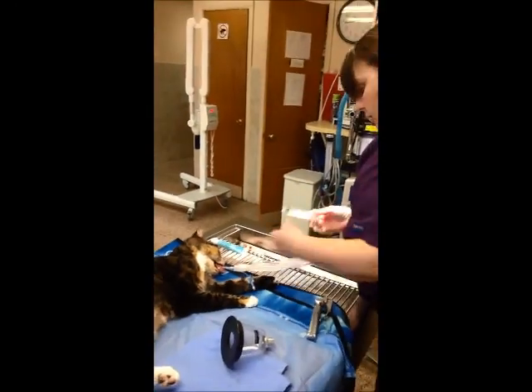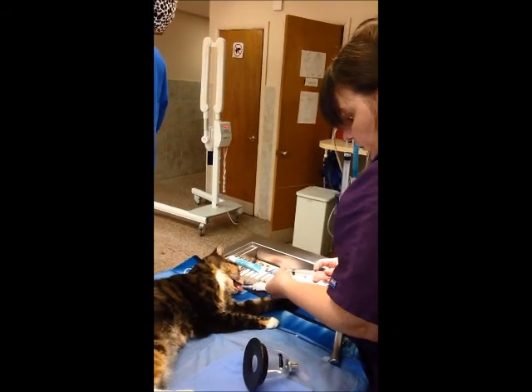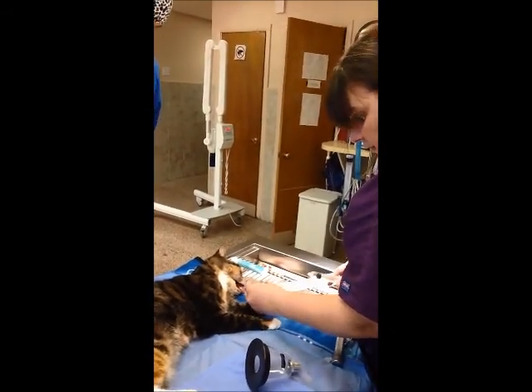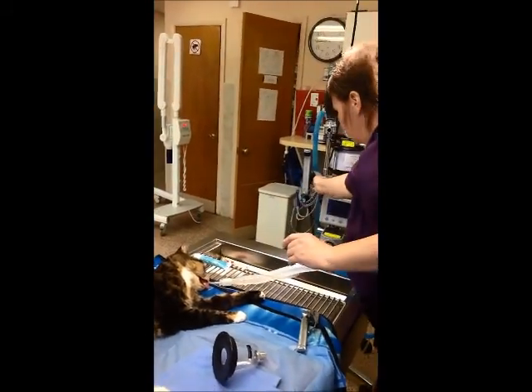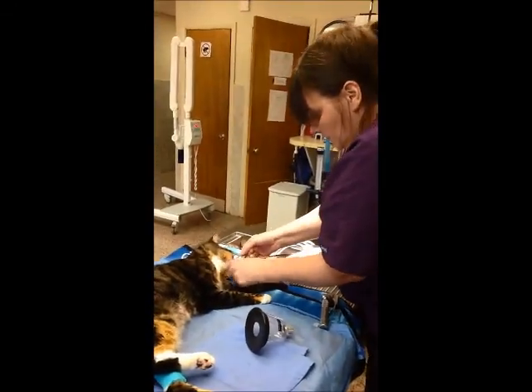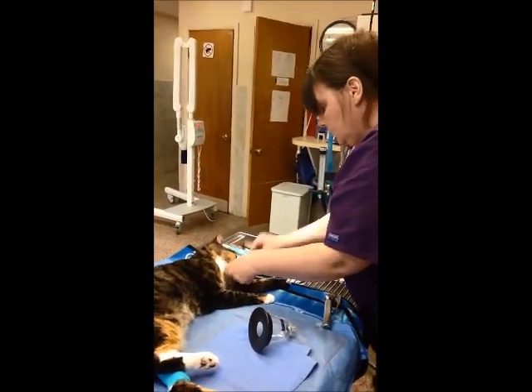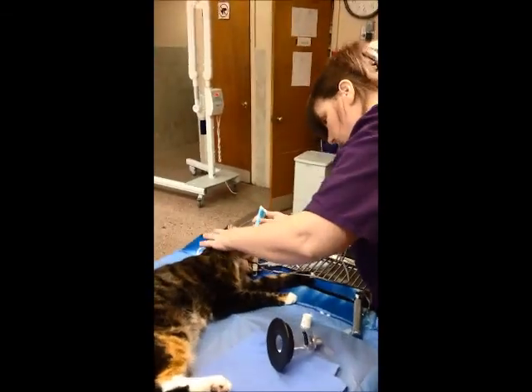I'm going to take her pressure cuff and fill it up, so there's just a little bit of back pressure. Don't want it too tight. I want to feel it's a little firm. Now her SpO2, so we can begin to monitor. And then I have her eye move.